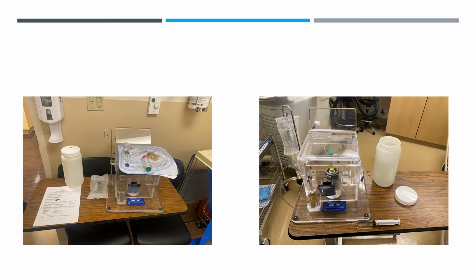They put the dose inside of there, and they don't open the dose until, because again, that's a dead one, they don't open the dose until they get into the OR, and you see that syringe with the yellow and green cap. Basically what they do is they'll puncture the top of the dose inside of the gray case. It kind of comes in like aminophylline. You know how it comes in those little vials? That's what the dose comes in too. So you have it all in this box. You puncture it, and you don't even expose it, right?